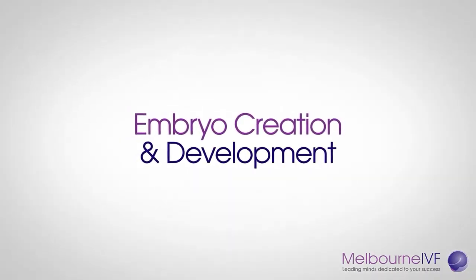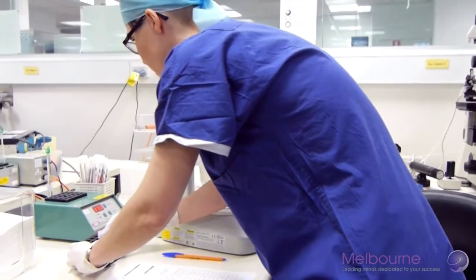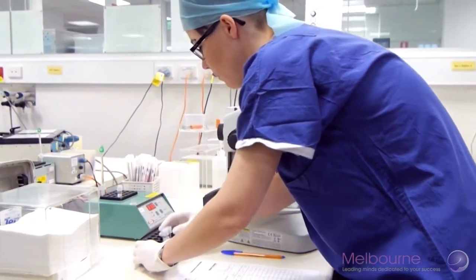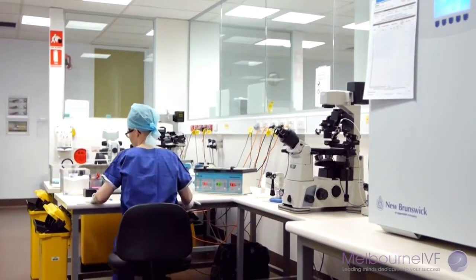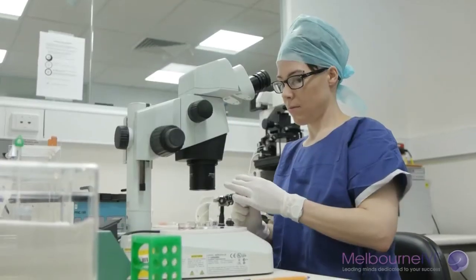Embryo creation and development. In IVF treatment, an embryo needs to be formed and develop before it can be transferred to a woman. This involves many steps over several days and begins with the egg collection.